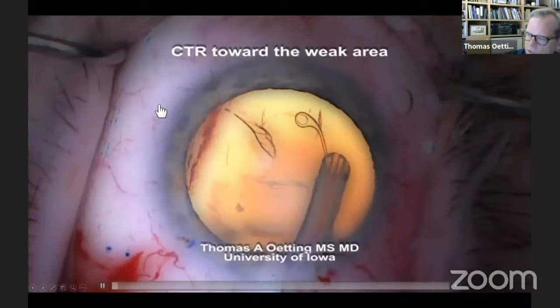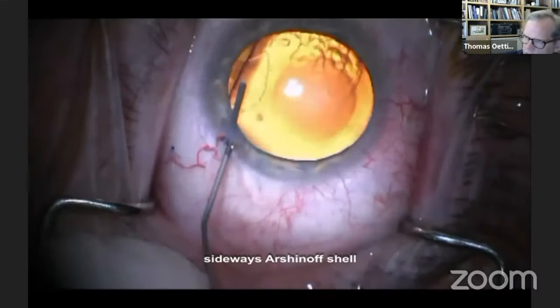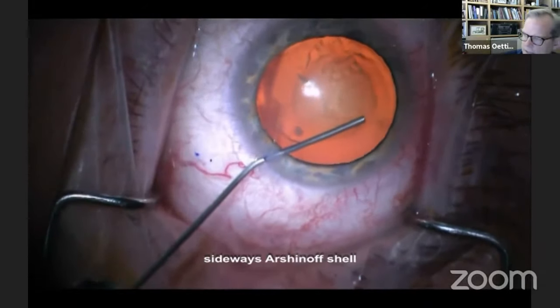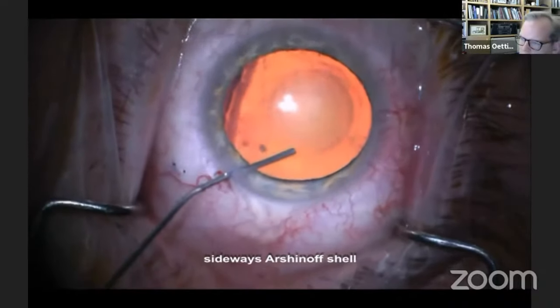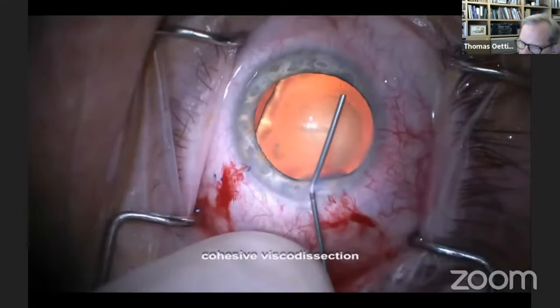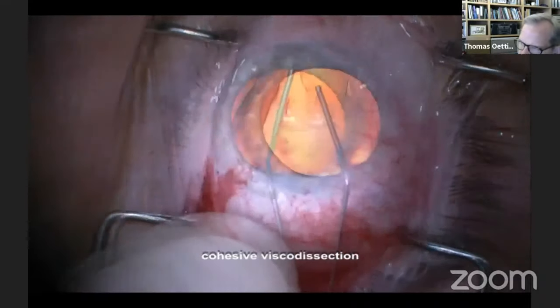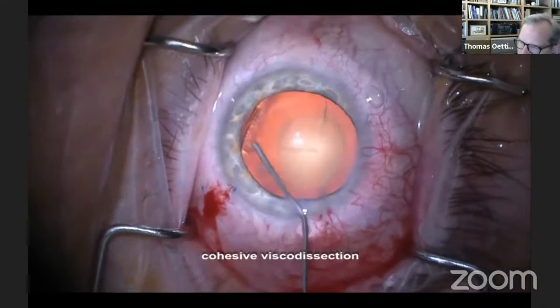So here's an example that shows a couple of those tips. You can see there's an area of weakened zonules on the left there. We're going to do the sideways Arshinov shell where we place the dispersive viscoelastic first. Now we're placing cohesive viscoelastic, and we're going to jam that dispersive viscoelastic into the area of the weakened zonules. Now we're going to make our rhexis, and we're going to center the rhexis on the lens, not on the pupil. And now we're using cohesive viscodissection for the planned early placement of a capsular tension ring. We're getting just under the anterior capsule with a cohesive viscoelastic.